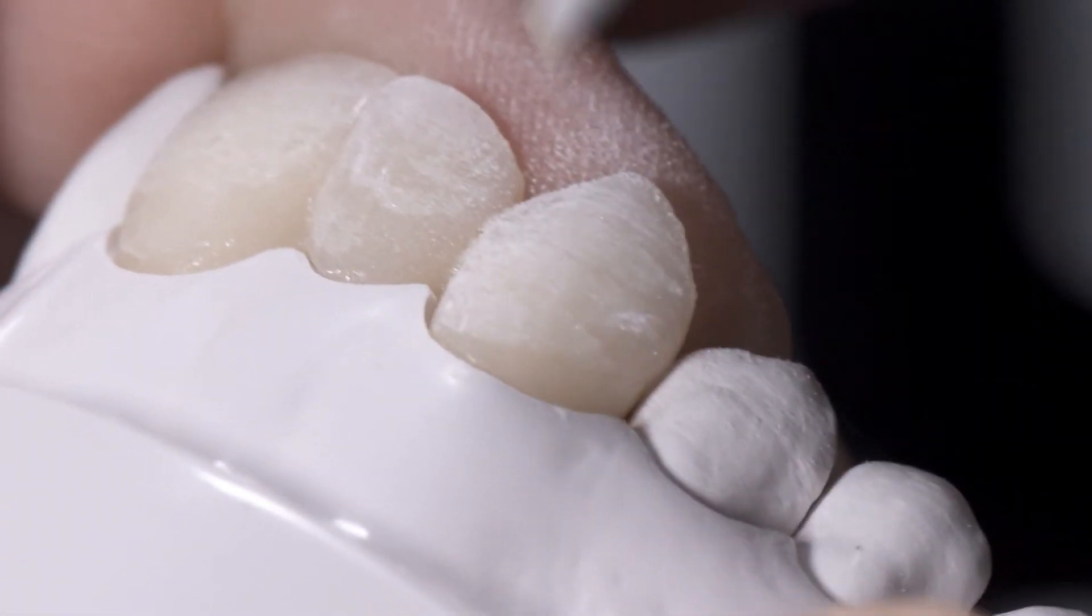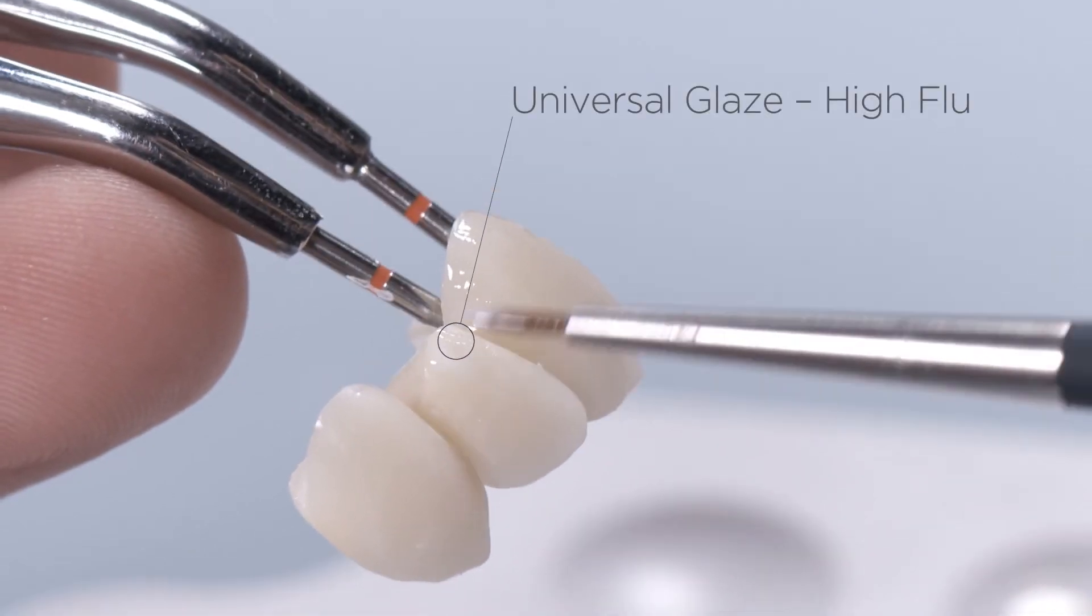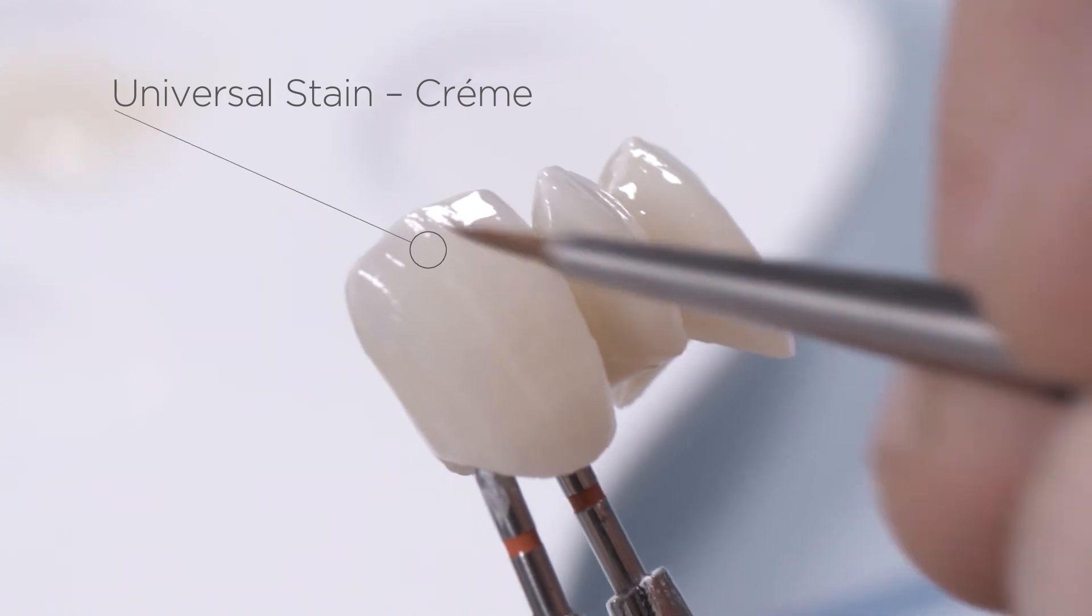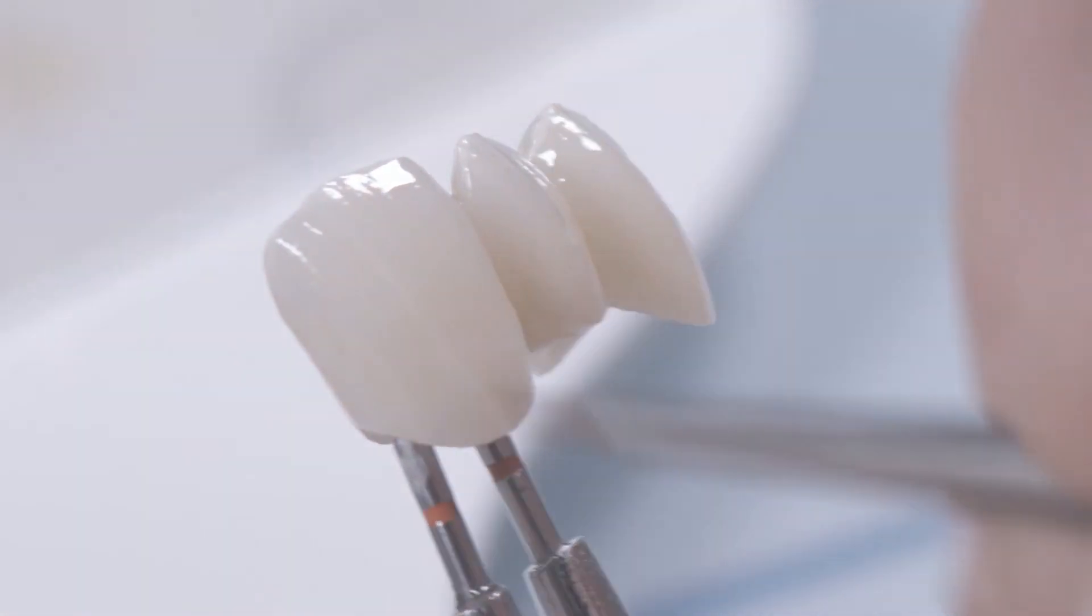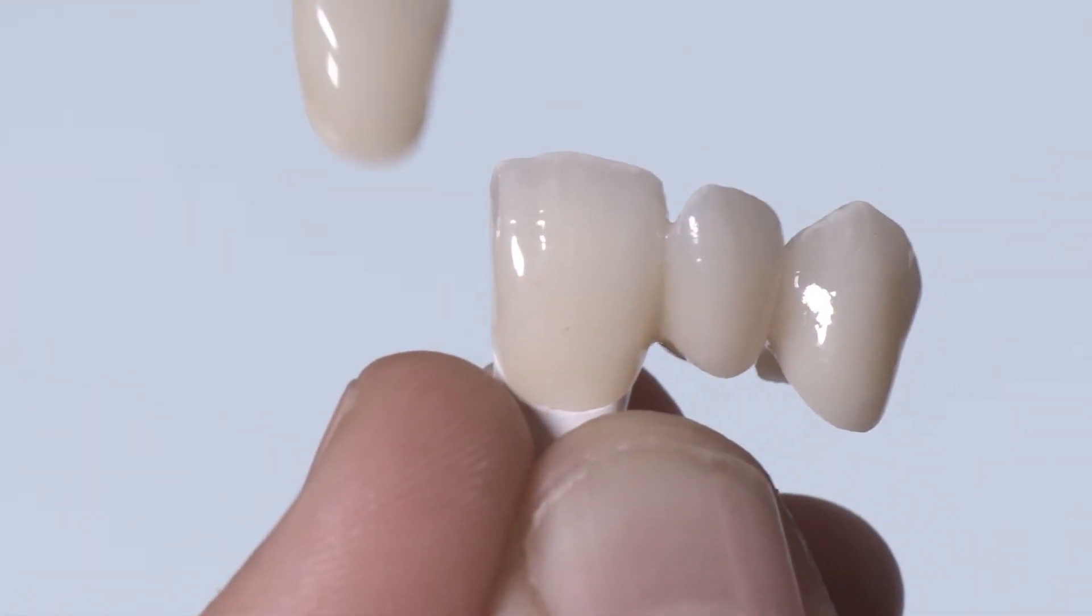The entire surface is glazed with High Flu Universal Overglaze, followed by adding delicate custom features in the incisal areas using Cream Universal Stain. The result, a perfect shade match. The opalescence of the incisal edge supports the natural appearance of the restoration.